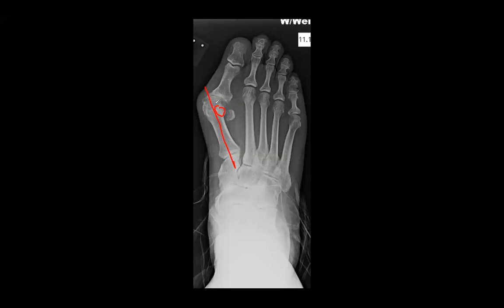5? Yeah, I see some 5 to 6. Again, my preference, if you get 5 or 6, that's fine. If you said this is a 4 or a 7, not as much. What we like to think of is if you look at the sesamoid, and if the sesamoid is right down the middle, when you bisect the first metatarsal, that's a 4. And then a 5 should have some sort of overlap, and a 6 would probably be just touching, and a 7 would have some gap there.